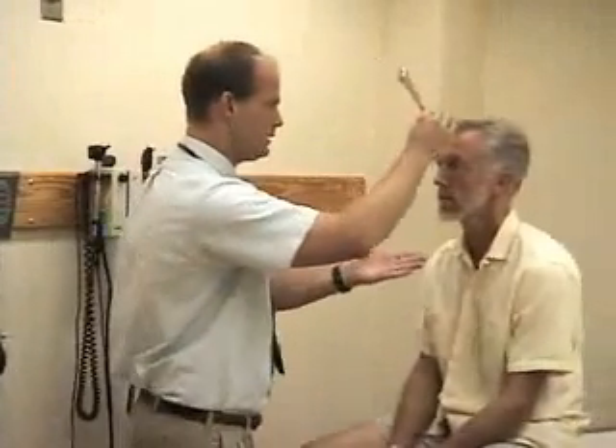Here I have my 256 hertz tuning fork and I'm first going to do the Weber test to see whether bone conduction lateralizes to either ear. I'm going to put this right in the middle of your forehead — can you hear this more in either ear? No, equally well. Okay.